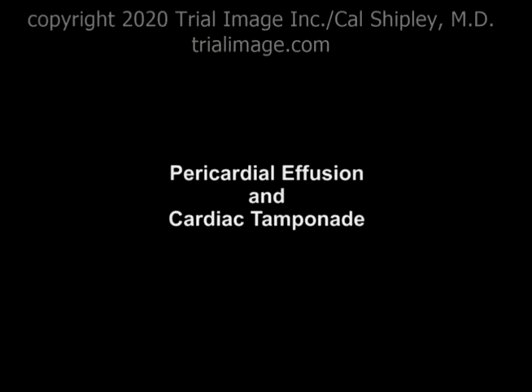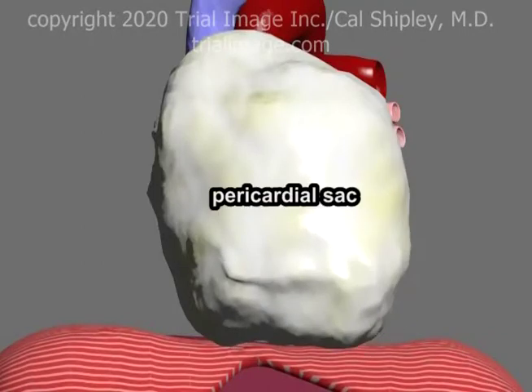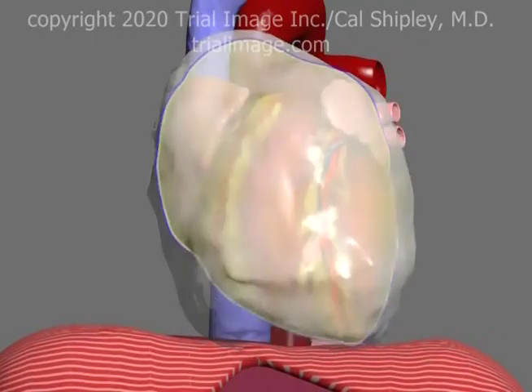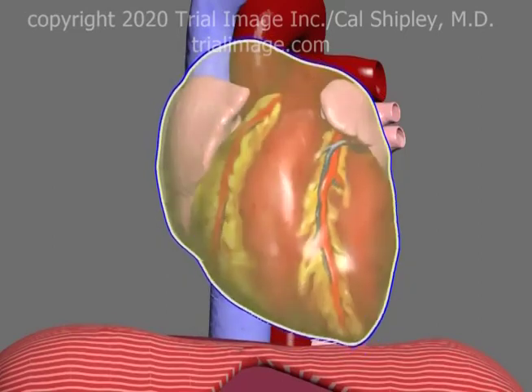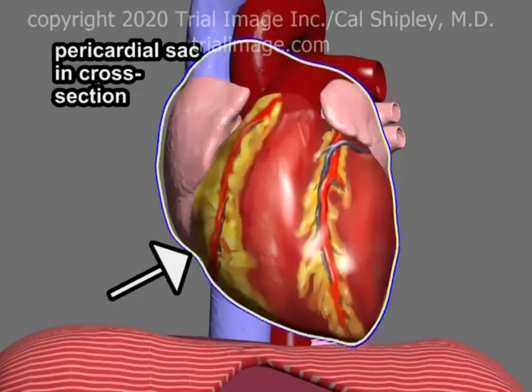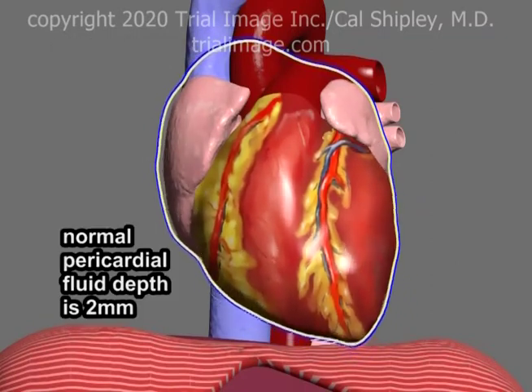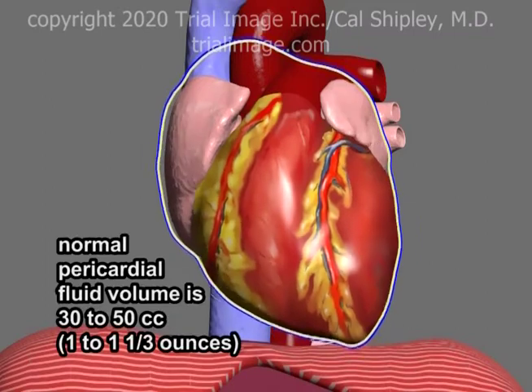Let's take a look now at why we perform pericardiocentesis: to remove pericardial effusions and prevent cardiac tamponade. Returning to a view of the pericardial sac in cross-section reveals a normal pericardial fluid depth of about 2 millimeters, which again corresponds to about 1 to 1 and 1/3 ounces of pericardial fluid.